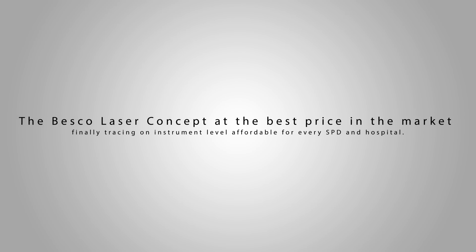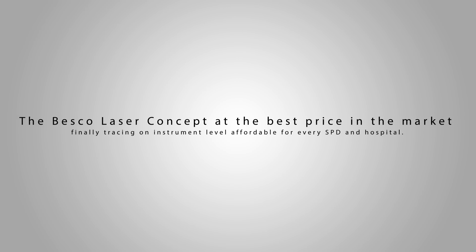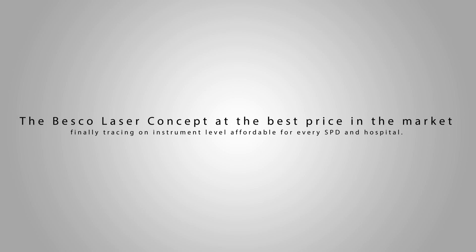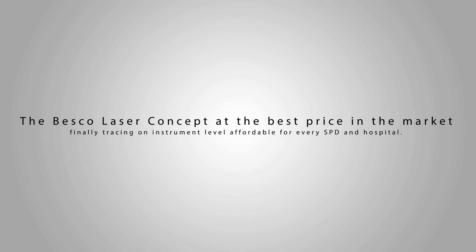The Besco laser concept at the best price in the market, tracing on instrument level is finally affordable for every SPD and hospital.